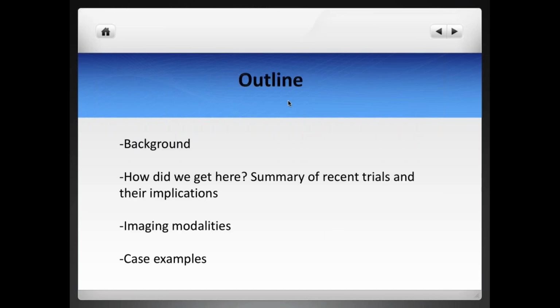What I plan on doing is go through the background of stroke and talk about what got us to where we are. As many of you know, we are in very exciting times in stroke. I wanted to bring us all up to the same page on where we are currently in stroke and why imaging plays such an important role in triaging these patients.